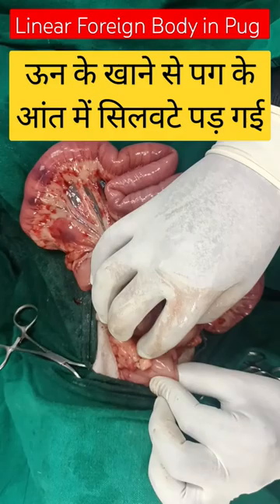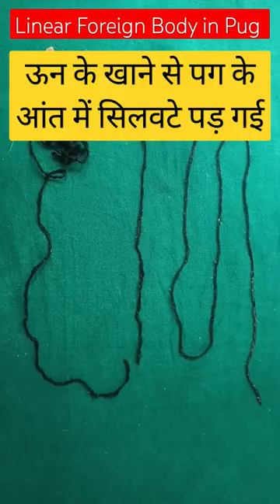We performed the gastrotomy and then made one incision in the intestine, through which we removed the linear foreign body. You can now see how the intestine has become normal — relaxed and straightened. It is no longer plicated.